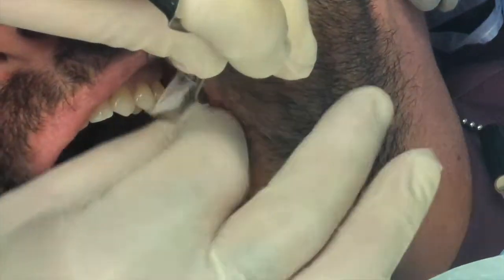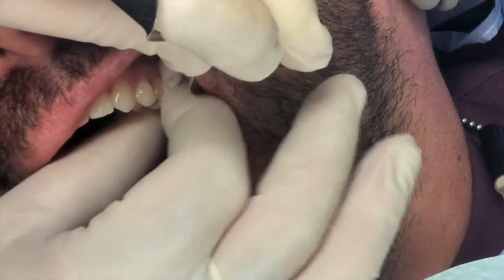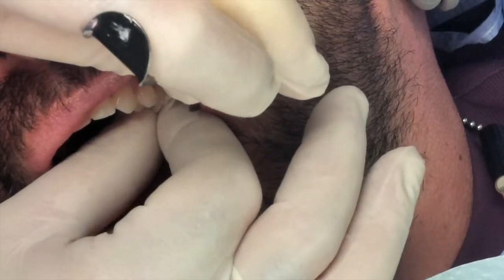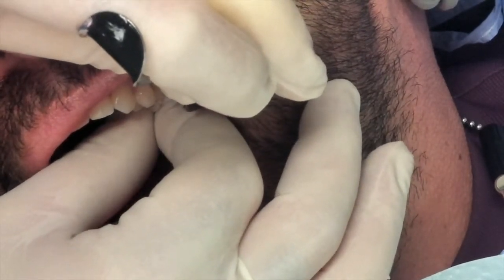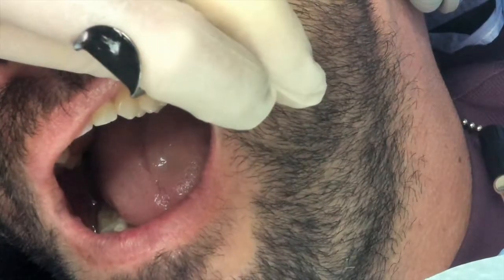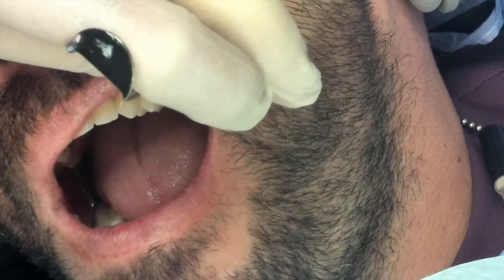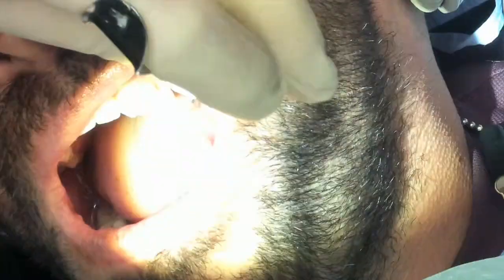We had a patient come in today for a post-op that we did a sinus graft on. The margins, it was 11, 12, 14, 13, 15. In 11 and 12, the lab had the margins a little short, so we prepped back on the abutment, did some flowable composite. We took the pictures. The post-op is beautiful. And you just can't do that with every system.